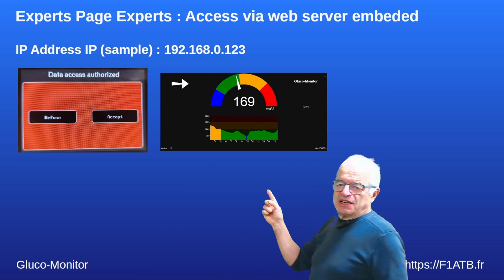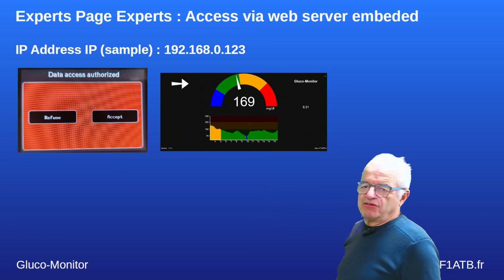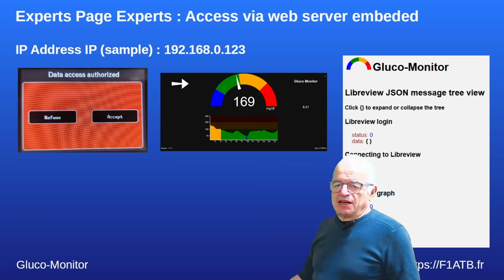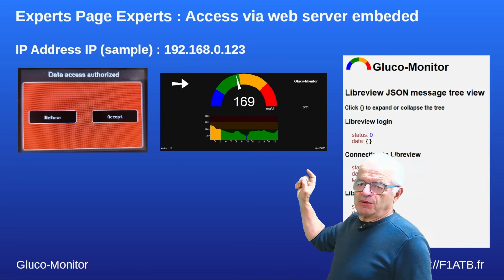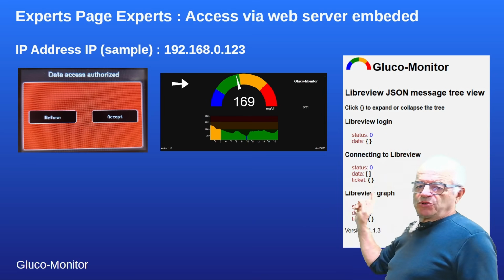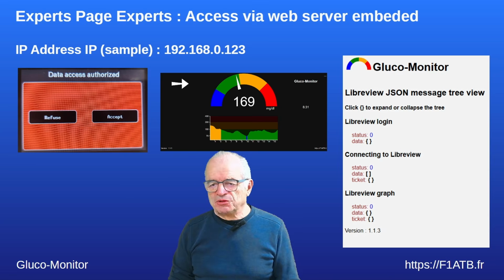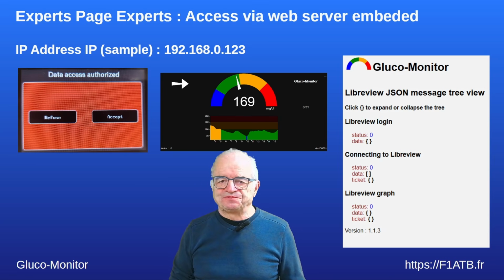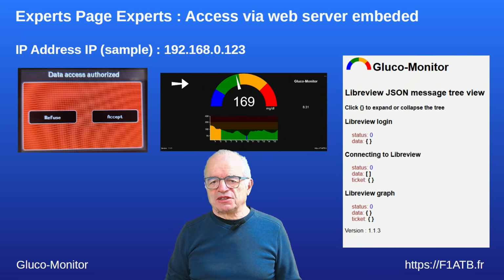You will find exactly the same figures and pictures as you have on Gluco-Monitor. And if you click on the small dots on the top right, you can access a page in which you have the answer of the cloud. You have the result received from LibreView Cloud, and you can click on it and see all the details of the data which are transferred.